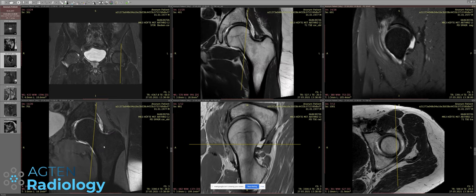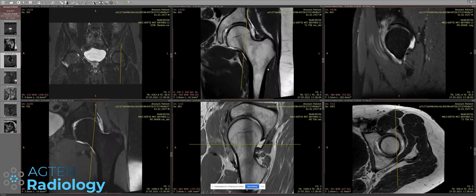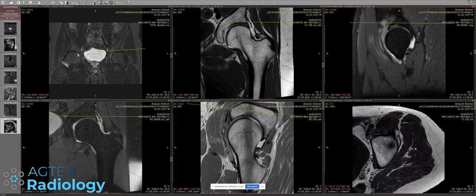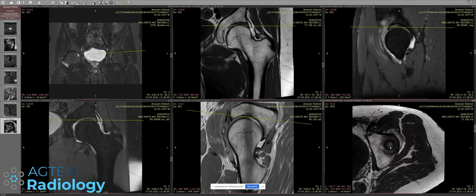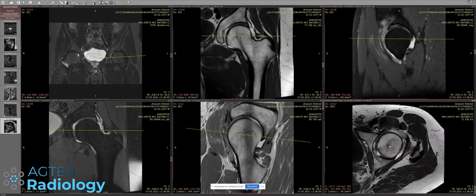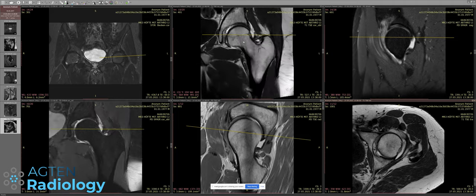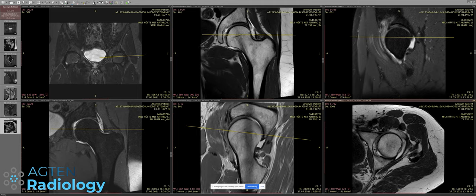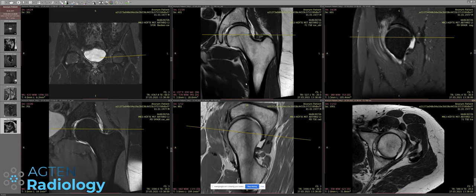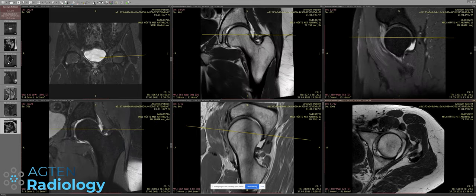Soft tissue contamination is very common and not really a problem. There is no T1 fat-saturated sequence for some reason — this is a private institution and they just have a T1 at the most cranial aspect of the hip, probably to assess for acetabular retroversion. There's a T1 coronal but I would prefer fat saturation. The other sequences are PD, so I don't really understand the protocol here.